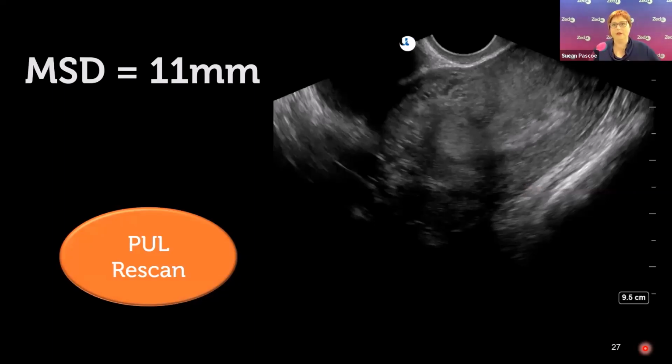So depending on what the ultimate goal is, if you've got an ongoing pregnancy that people are happy with and are keeping, then we want to wait until there is a definitive answer. If we're looking at pregnancy management options, we just need to confirm that it's in the uterus and that it's not an ectopic pregnancy. So we only have to wait until the yolk sac is visible to be able to call that.